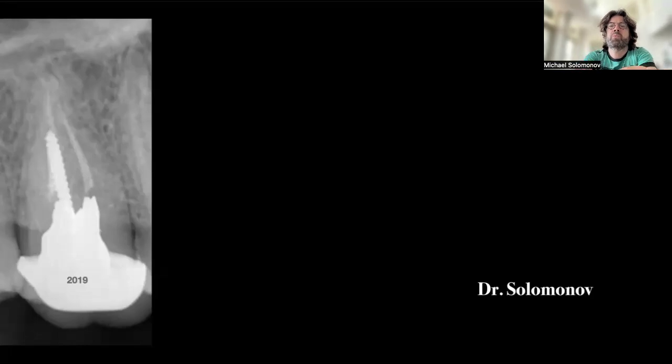The patient first came to my clinic in 2019, some 10 couple weeks before. During my examination: percussion negative, palpation negative, no pockets, no sinus tract, nothing. Also, I see no radiolucent area in the X-ray, and we decided between two possibilities, follow-up or CBCT, because we know that sometimes we can see an apical lesion in a CBCT scan that we can't find on the regular X-ray.